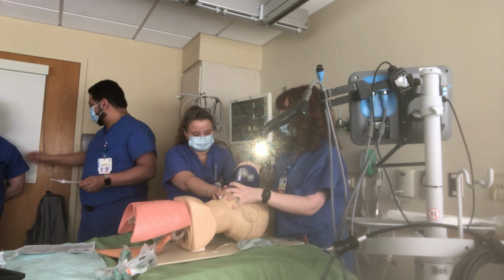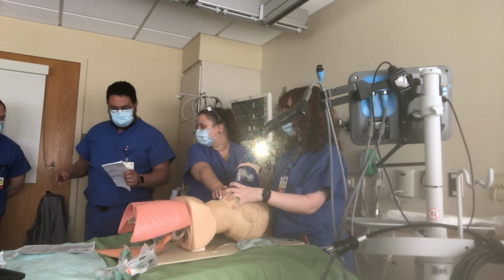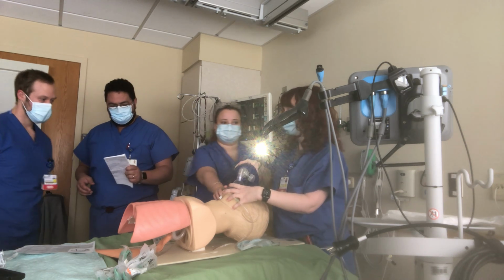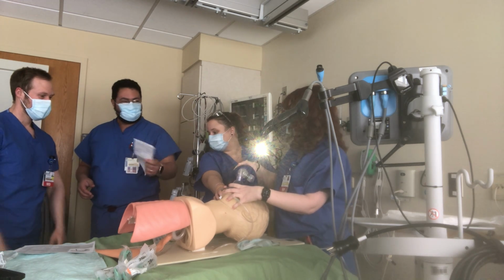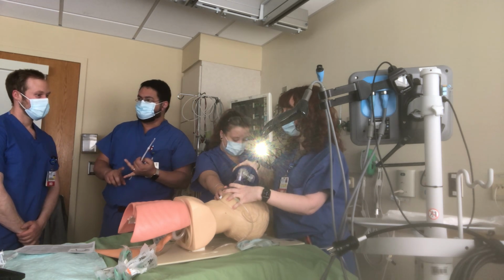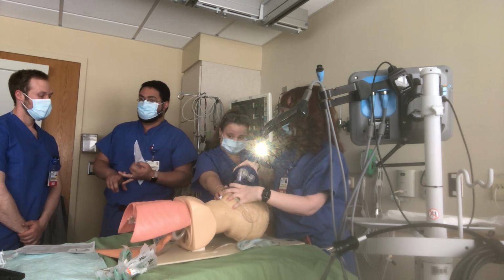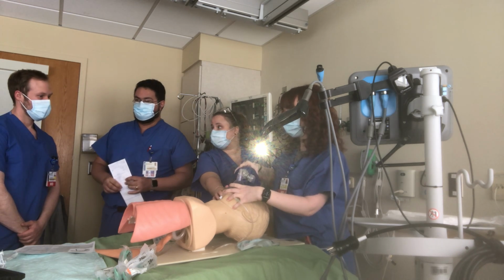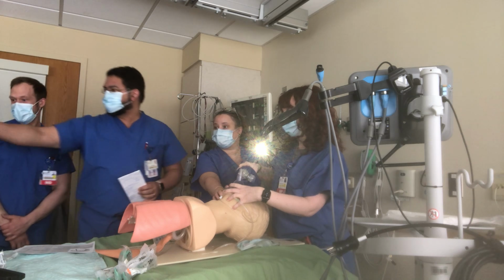Dan, right? Yes, you're gonna be next. So come close, Professor. What are you gonna do? We said we're not gonna do glide, right? Because it's difficult ventilation, we're not gonna put him to sleep at all. So what are we gonna do? Awake fiber optic intubation, right? We have the fiber optic here, right?